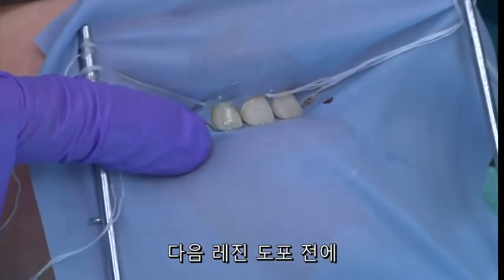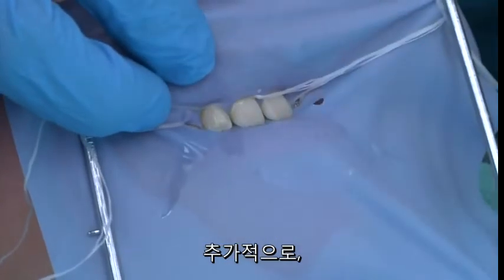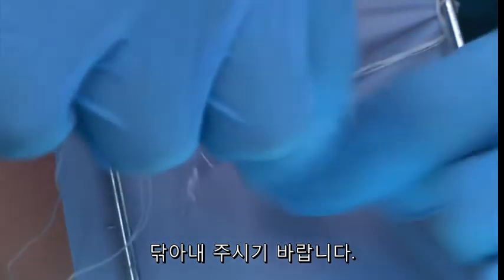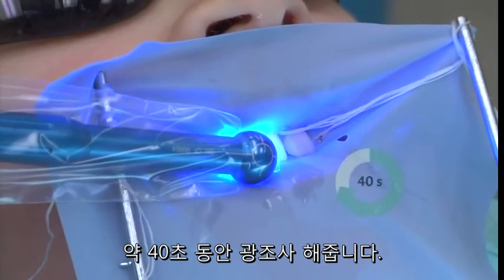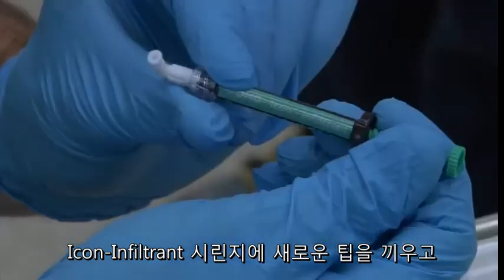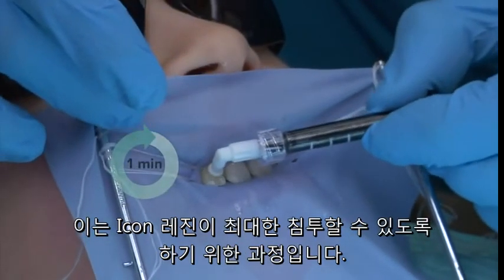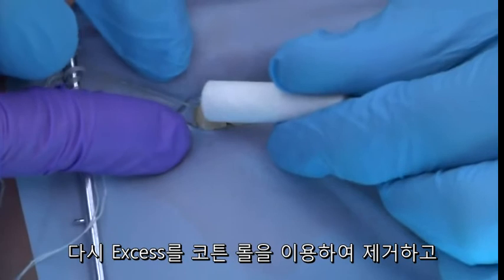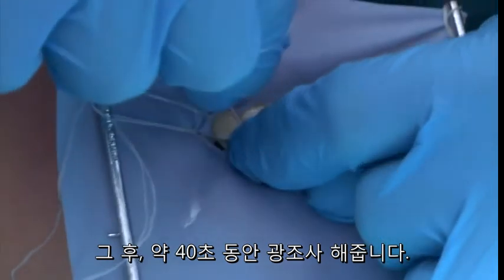Following the infiltration step, excess material shall be wiped off with a cotton roll. Additionally, be sure to clean the contacts of adjacent teeth with floss to avoid bonding teeth with excess resin. Then the resin infiltrant is light cured for a period of 40 seconds. Place a new applicator tip onto the ICON Infiltrant syringe and apply a second application of the ICON resin material for a one-minute period, in order to fully treat the surface and allow maximum penetration. Again, remove excess resin with a cotton roll, clean interproximal areas with dental floss, and light cure the surface again for 40 seconds.